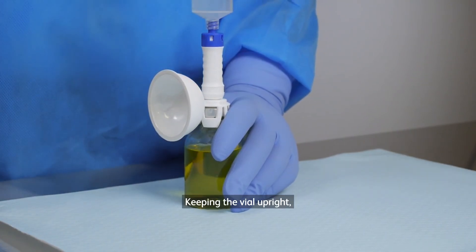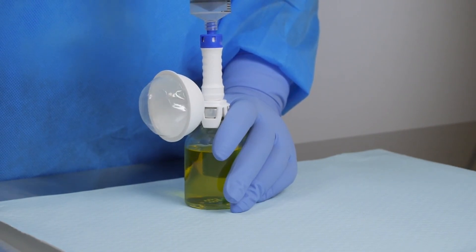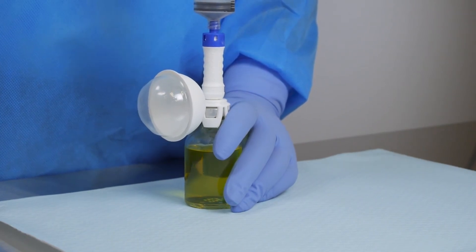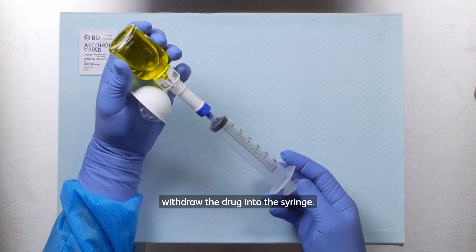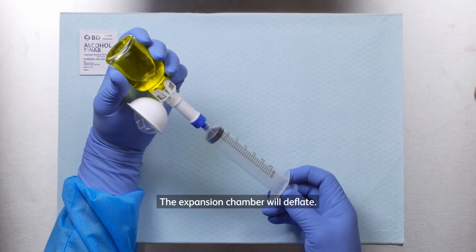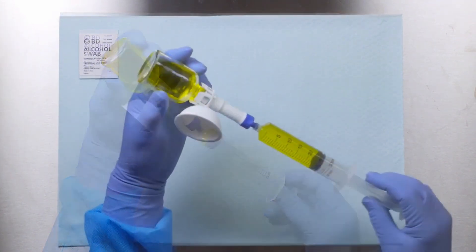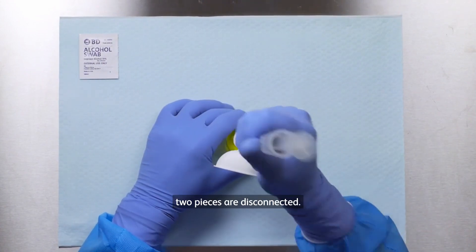Keeping the vial upright, push the air into the vial. The expansion chamber will inflate. Invert the system and withdraw the drug into the syringe. The expansion chamber will deflate. Pull the injector straight back until the two pieces are disconnected.